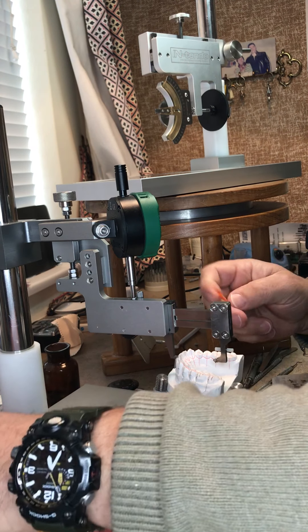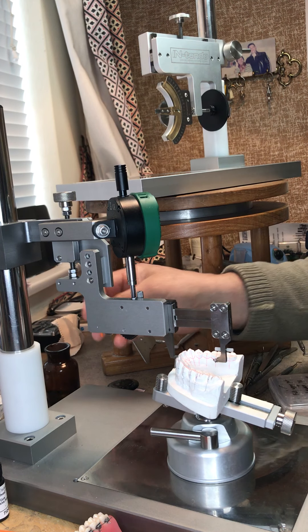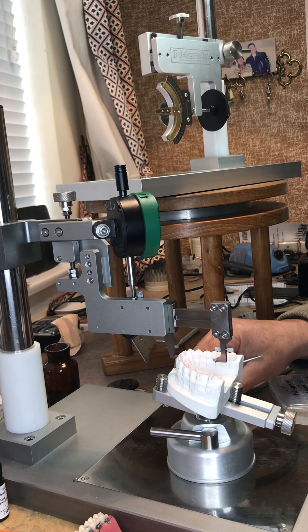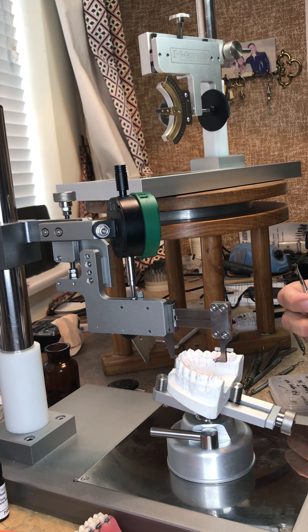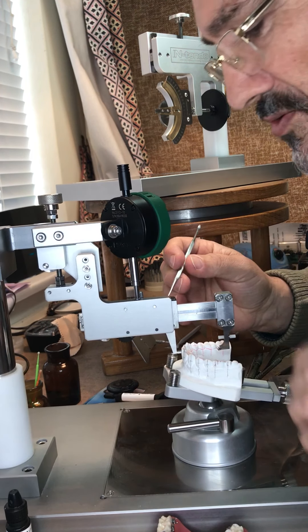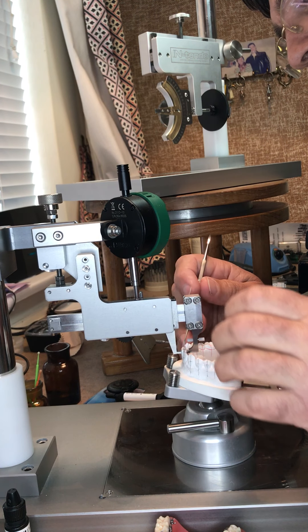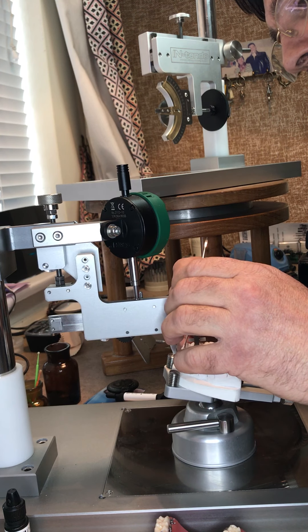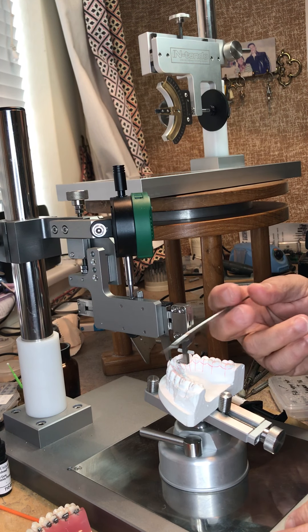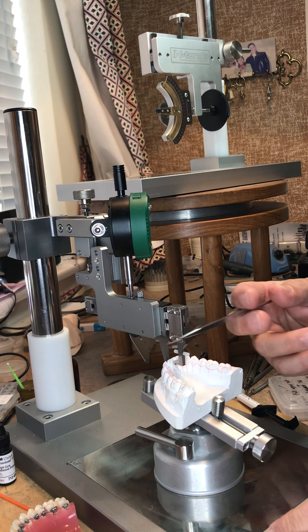You don't need a lot of this. Then I apply my composite. I can measure the thickness I'm going to use with the composite to compensate all of the teeth in the arch — or at least part of the arch, in this case the anterior — so we have no first-order bends. I put my composite behind it and push it in until I get the reading I want. I've decided this one will be five, so now it's exactly five.